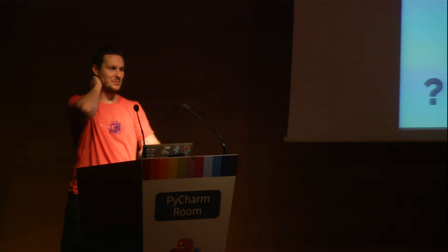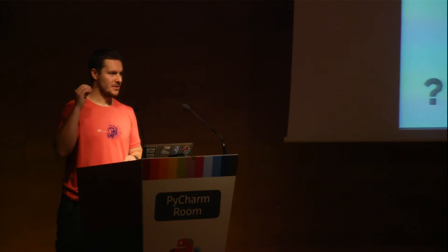Okay, so there are some specifics of this type of images regarding other libraries. For example, doing brain images with scikit-learn. For diffusion images, you need very specific models to fit to your data. For functional images, you could.